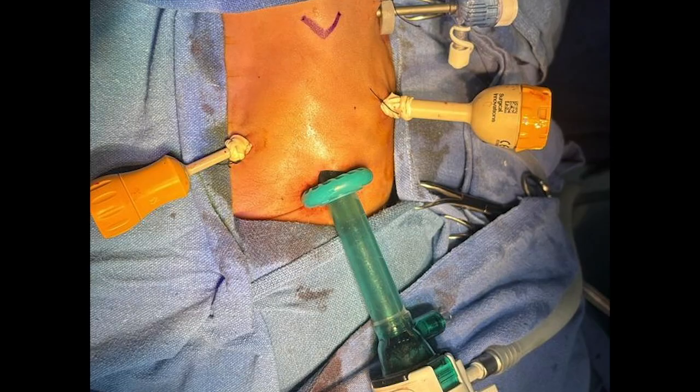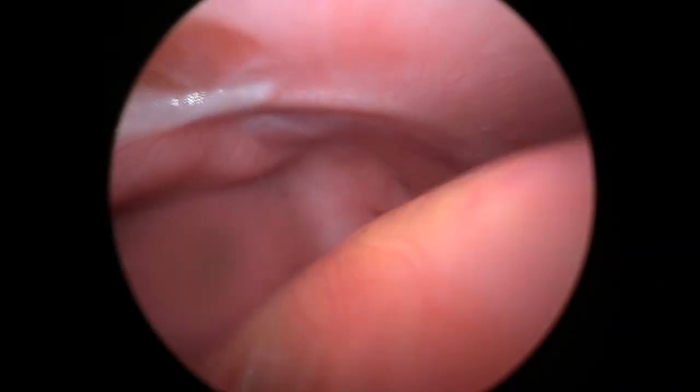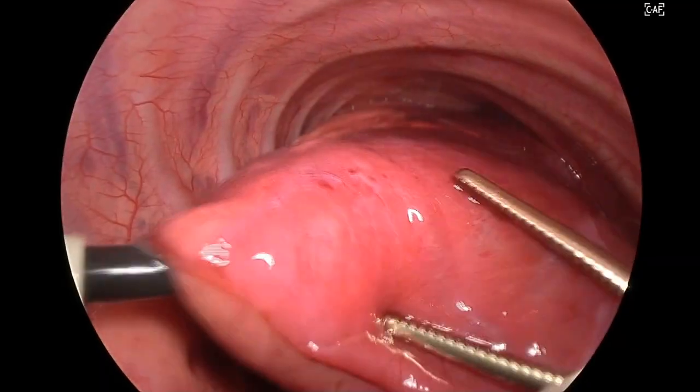We could not achieve a single lung ventilation. So the position was lateral, and there were four ports that were used: two 3 mm, one 10 mm and one 5 mm. The camera port is inserted as caudal as possible, as we can see in this image. We are using another camera through another port to see that the port is right above the diaphragm.